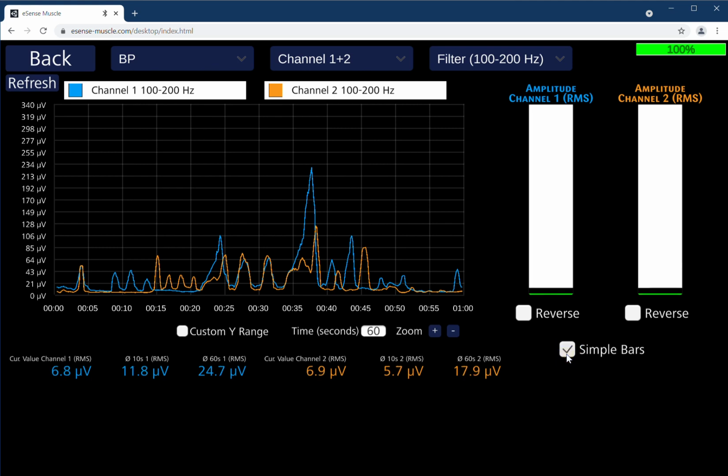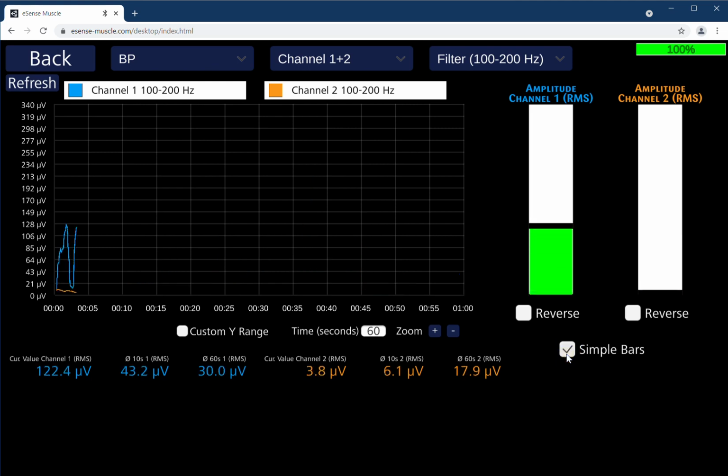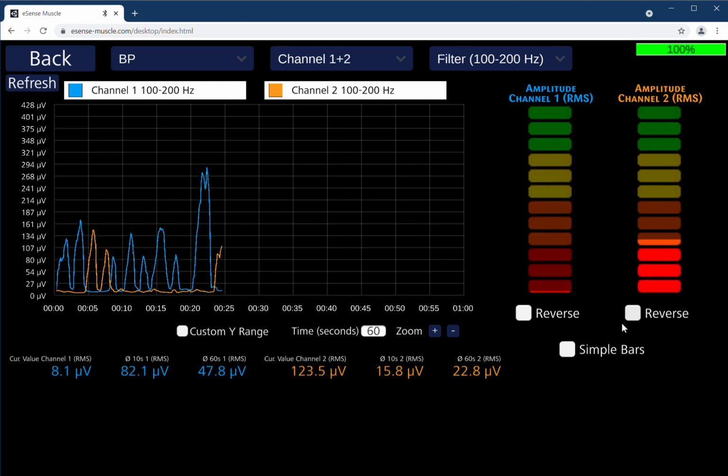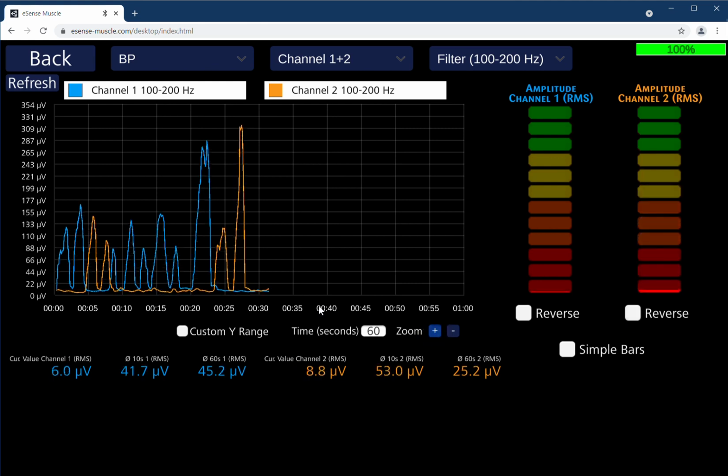I can also change to simple bars like these going up and down and being green like that. I can reverse them, so then it's like that, or in this case it's like that you need to lose tension you have already, or this is that you are rewarded when you are strong to contract really strong. Okay, you can change the zoom here, you can change the x-axis here, you can change the y-axis, and you can also change here the channels and the filters at the top for that. So this is very well known for anybody who has ever used EMG biofeedback before.